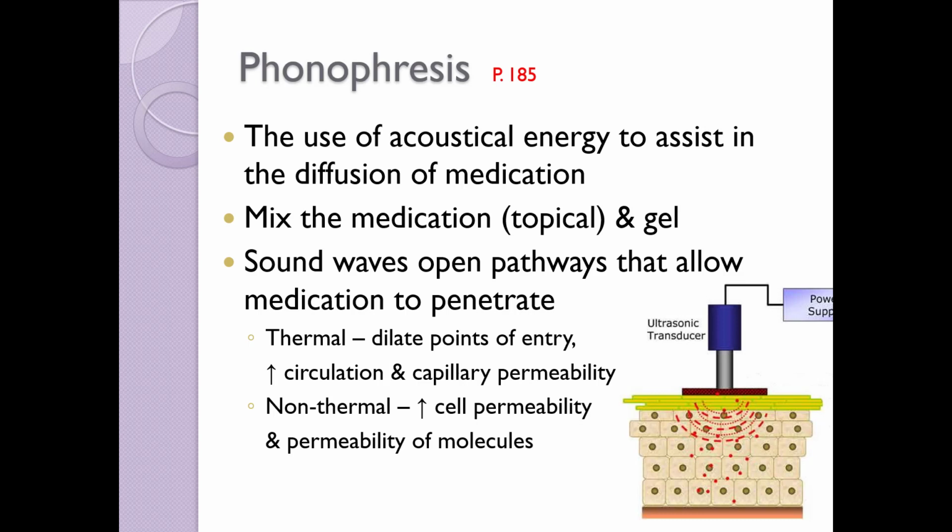Ultrasound will result in what's called sonoporation, in which the sound waves increase the cell membrane permeability, thereby facilitating the delivery of the molecules to precise locations in the body. The successful delivery of medications is limited by the inability of the molecules to cross biological barriers, like the cell membrane. An advantage of phonophoresis is that medication can be delivered via safe, painless, and non-invasive techniques.